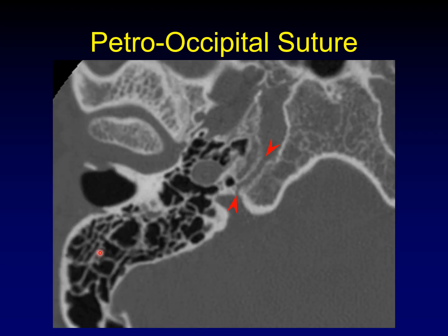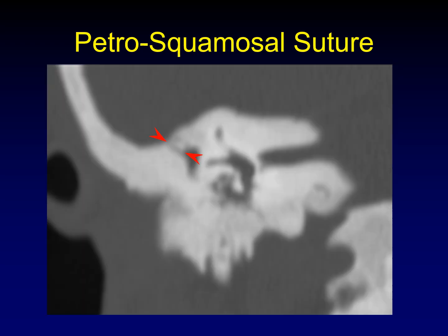Our next is the petrooccipital suture that lies along the lateral aspect of the inferior clivus. Then the petrosquamosal suture — I had to find a patient with osteopetrosis to show a good example of this, but this runs from the middle ear cavity up to the middle cranial fossa. It's usually difficult to appreciate, but it can, if it gets enlarged, look like a gap in the tegmen.